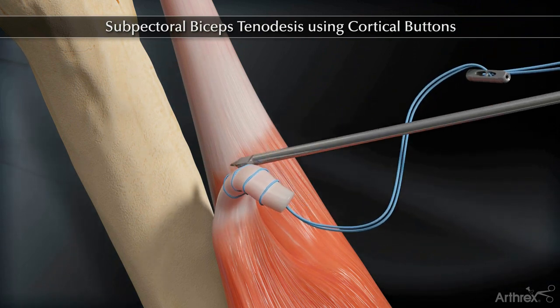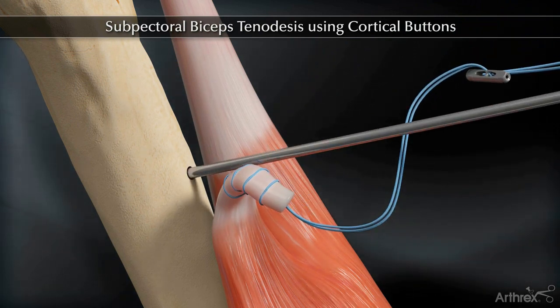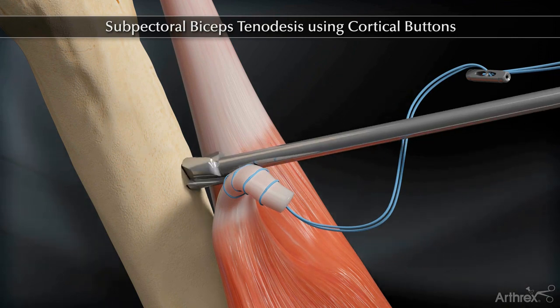Drill a bicortical tunnel one centimeter above the inferior border of the pectoralis tendon, then drill a unicortical tunnel over the guide pin.